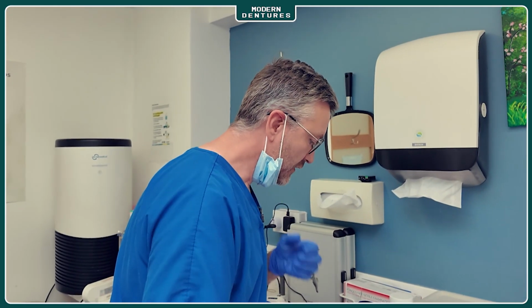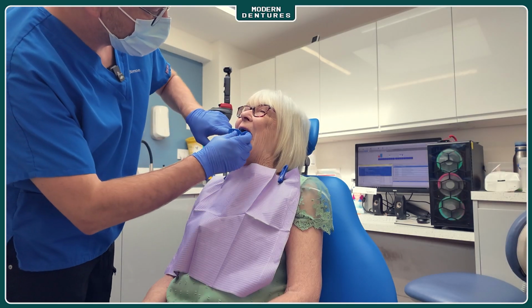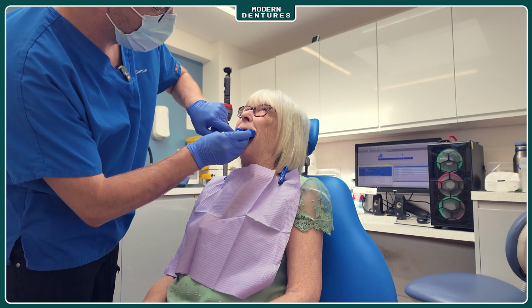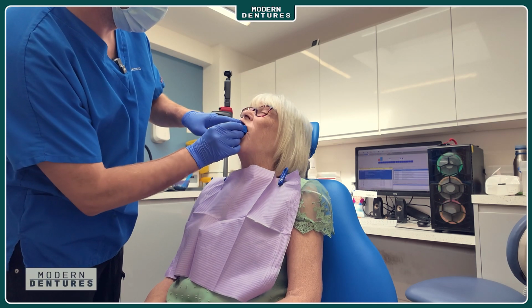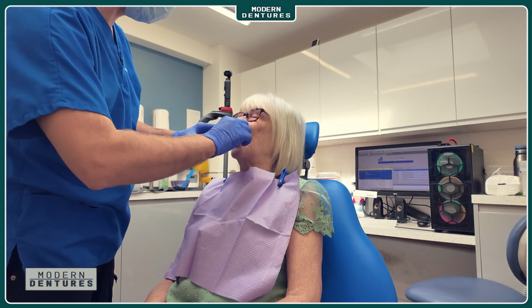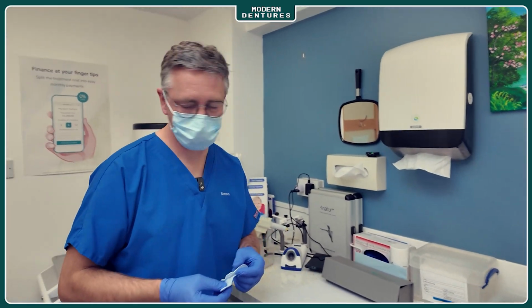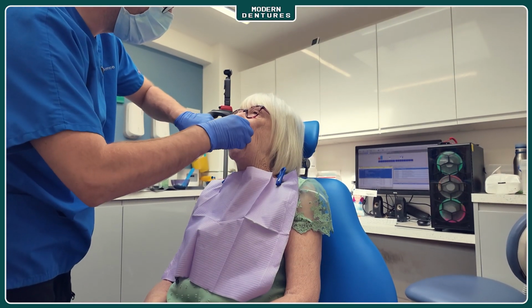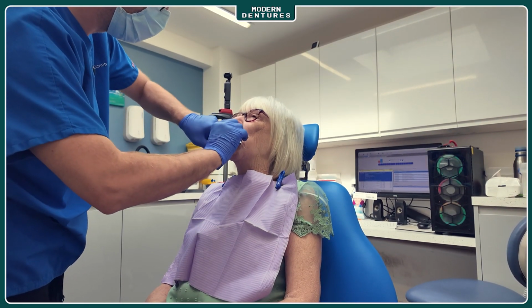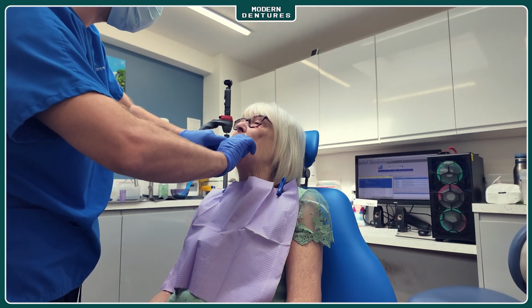So we start first of all with checking the trays. I'm just going to pop this top one in. Just relax your lips for me, that's it. That's okay. I'll just take that out. And the lower one, relax your lips for me. And if you just poke your tongue out a little bit, that's it.